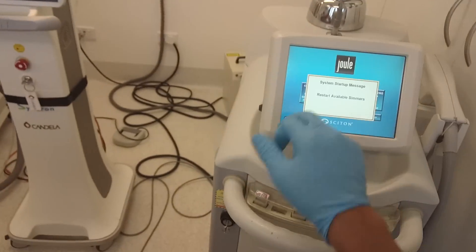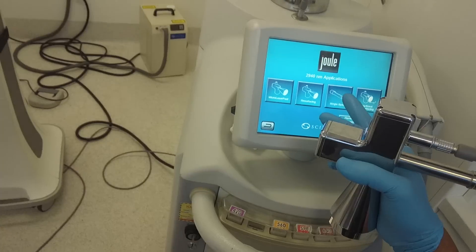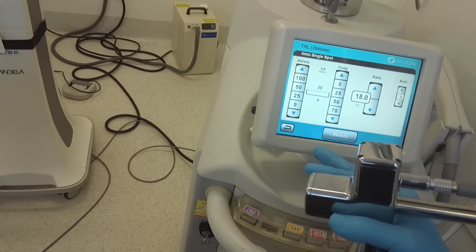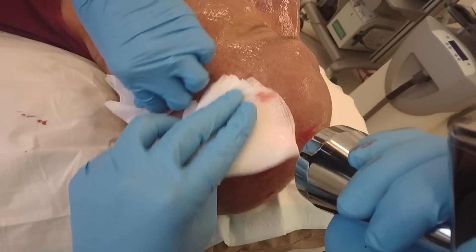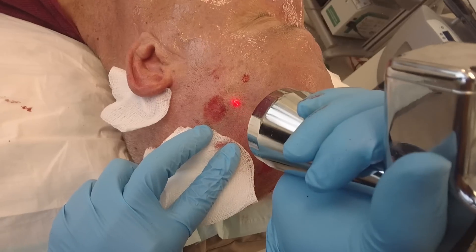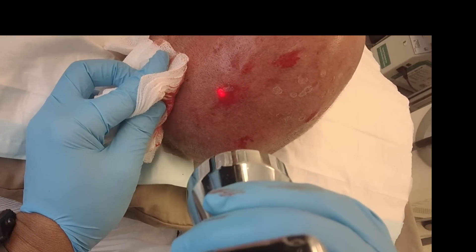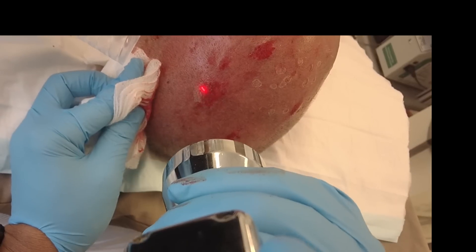We don't go beyond the hair follicles, so I'm just left with this. Then I use a laser and this gives finesse. I'm using an erbium laser and what I do with this laser is buffer out the edges. It's a very noisy but very accurate laser, and what it does is treat the edges of the lesion and the remaining senile keratosis. You can see me getting the smaller ones and fine-tuning the whole procedure so that it's very accurate.